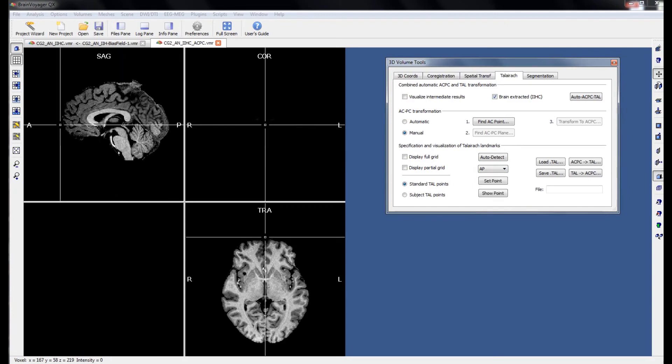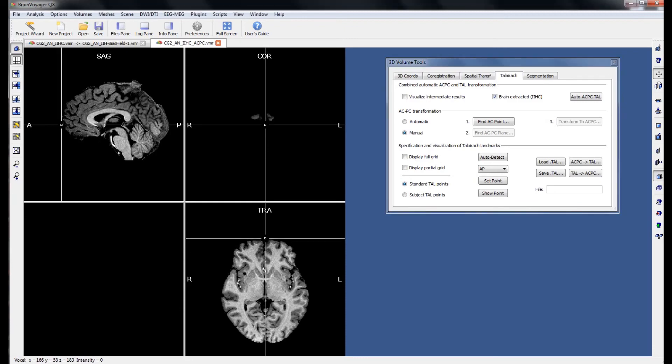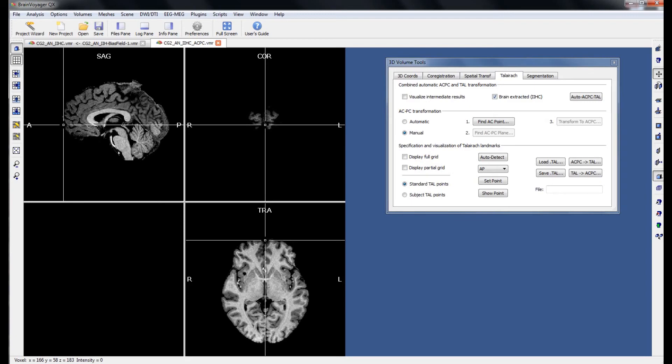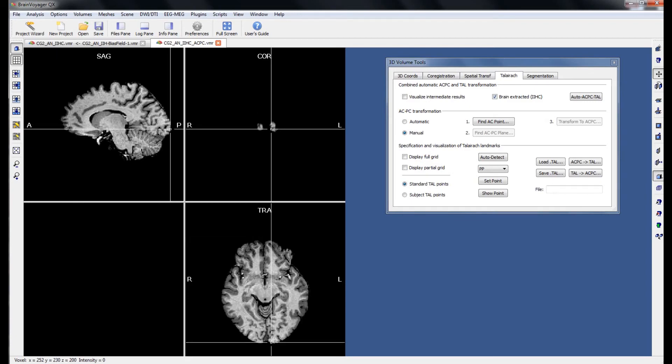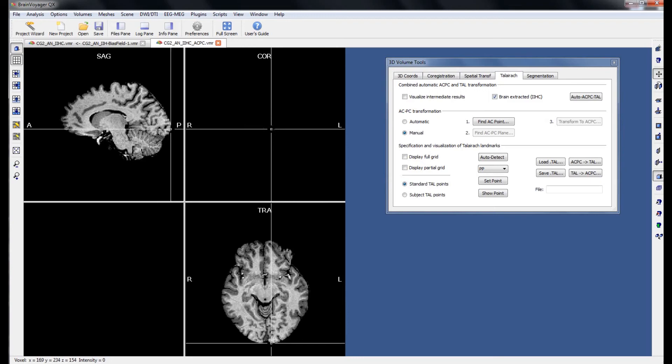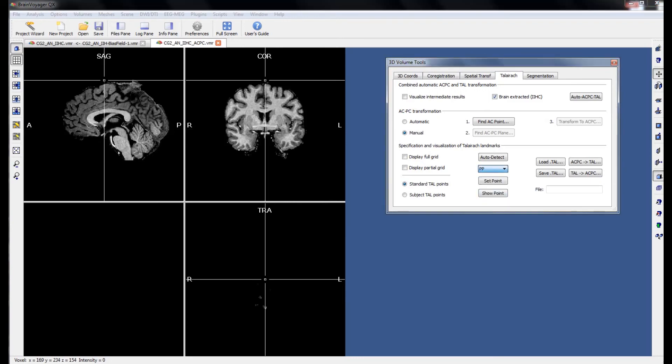The next point is the AP point, or the anterior point. This is the first slice in the coronal window where the cortex becomes visible. We can find this point by holding in shift and using the up and down arrow keys. The next point is the posterior point, and this is the slice in the coronal window where the brain first becomes visible at the back of the brain.